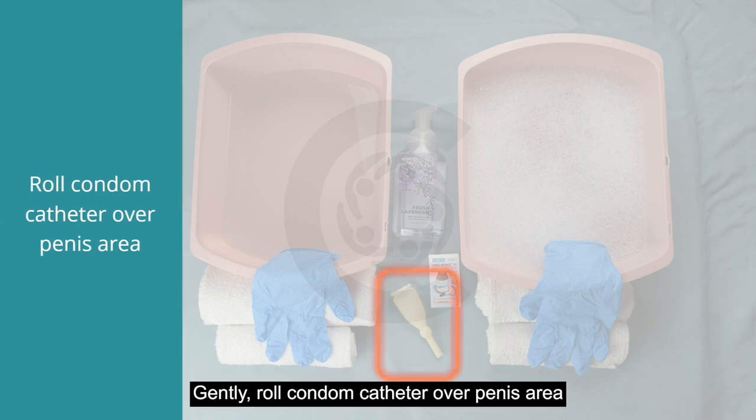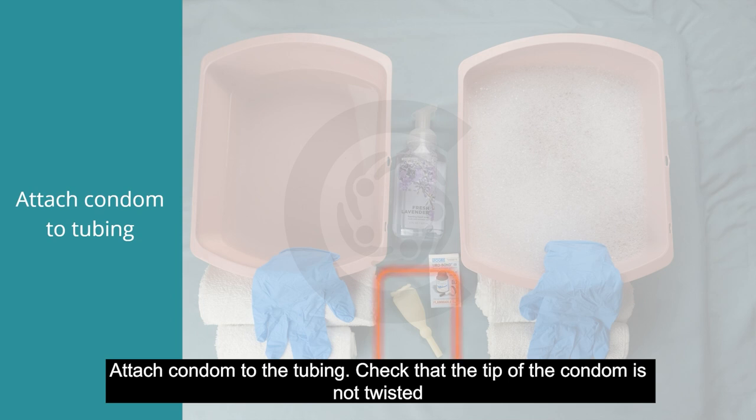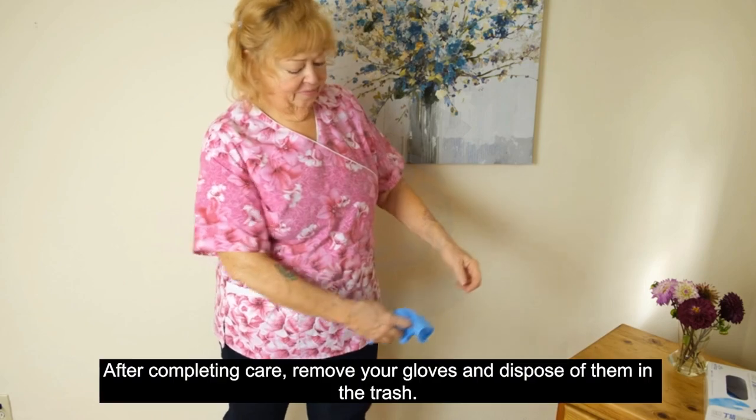Gently roll the condom catheter over the penis area. Attach the condom to the tubing and check that the tip of the condom is not twisted. Secure the tube to your client's leg using a catheter strap, and ensure the bag is below the level of the bladder.